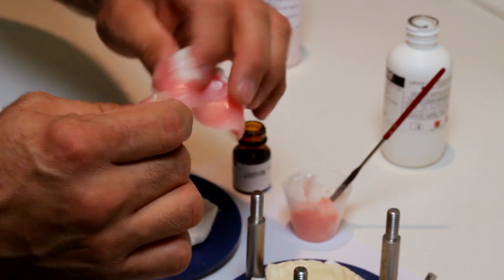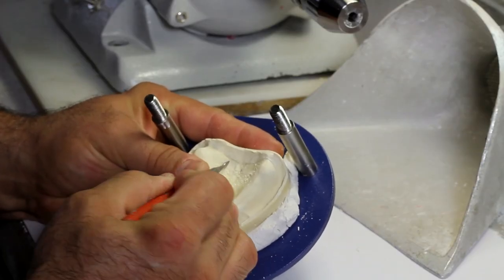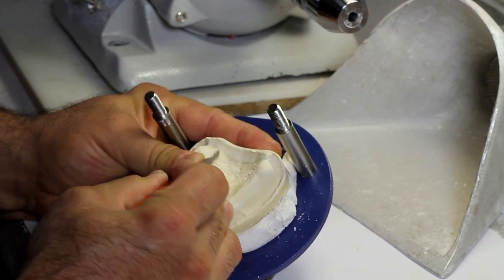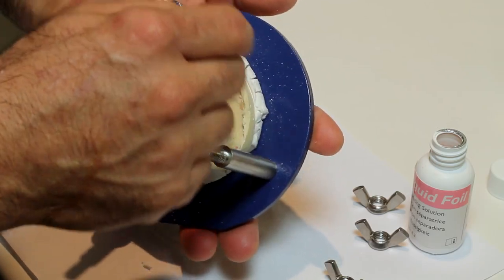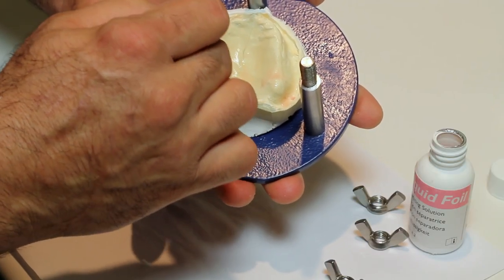Then, replace it teeth first into the jig. Carve a post dam on the working model to ensure firm palatal seal. Then, paint the working model with Lange's liquid foil and let it dry for one to two minutes.